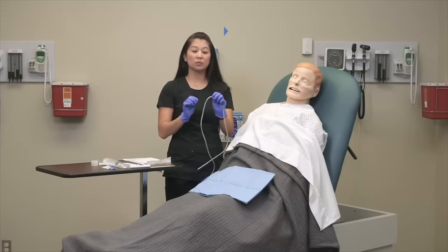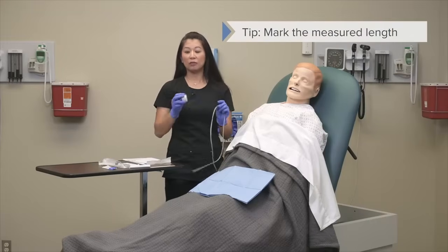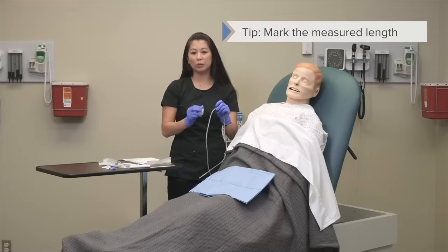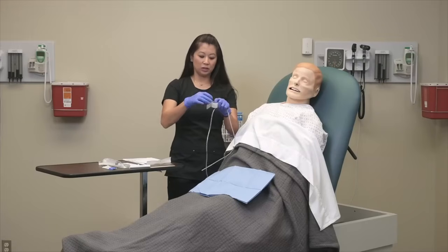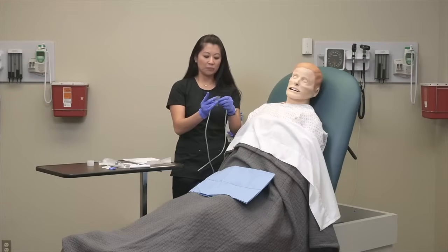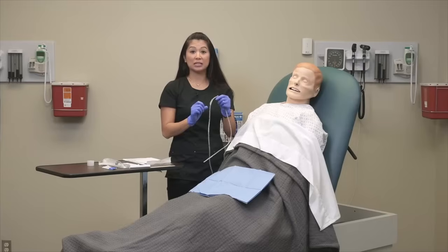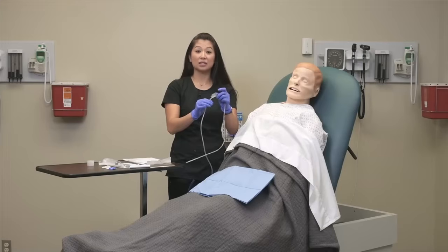Okay, so a couple of tips once you measure the length. It's really important for you to mark this. Every nurse has a preference. You can use a black marker, a permanent marker, which is a really great idea. That way we know exactly where the insertion piece should be. Also, another little tip: if you take a piece of tape and wrap it around where the insertion point should go, it doesn't have to be neat, then when you're inserting, you know exactly where to stop. So this is really helpful. And obviously, once you're inserting, you can take this off as well.